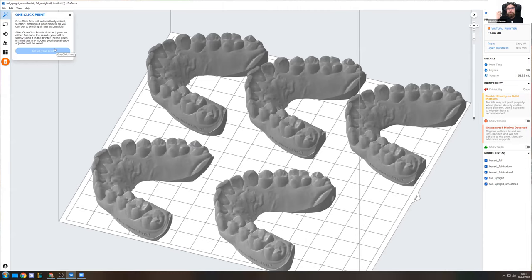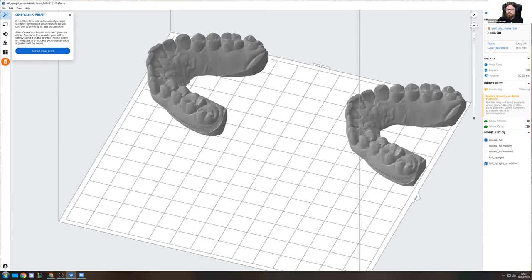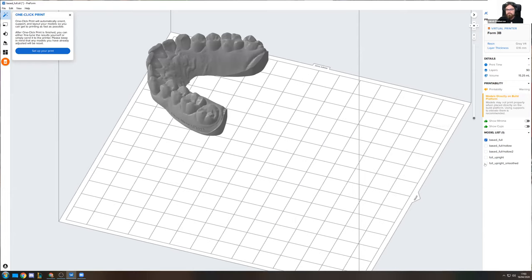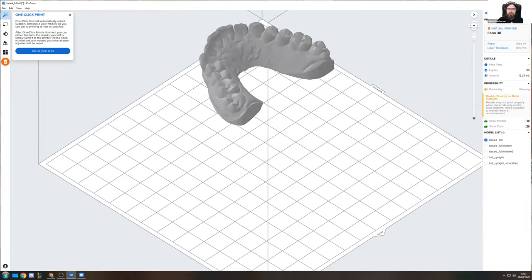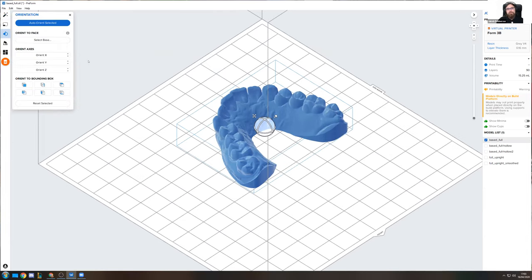already be sent off to the printer, and then you just have to go over to the machine and press start there, which is something I'm going to show you a little bit later on. But if you want to go in and do a couple of these things yourself, I'm just going to be hiding these other models for a couple of minutes here. Basically, what you will be doing is you will go over on the left side where you have all these tools available to you. And the first thing that we're going to do is the orientation of our models themselves.